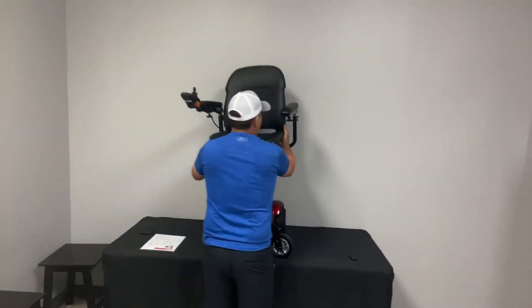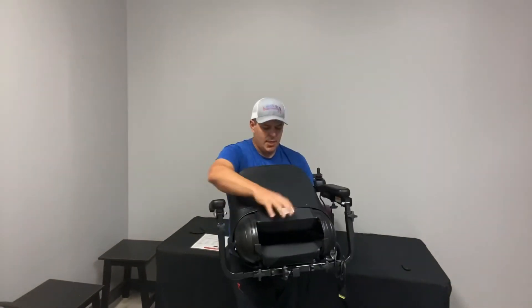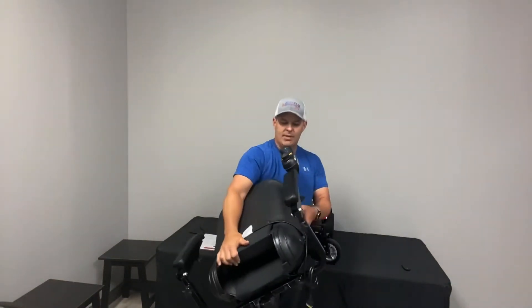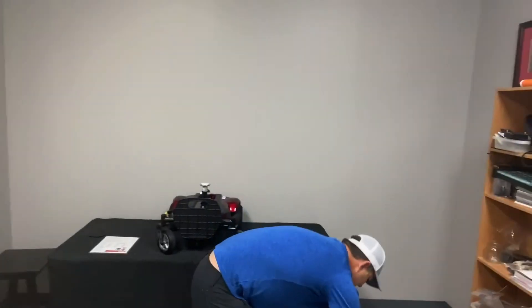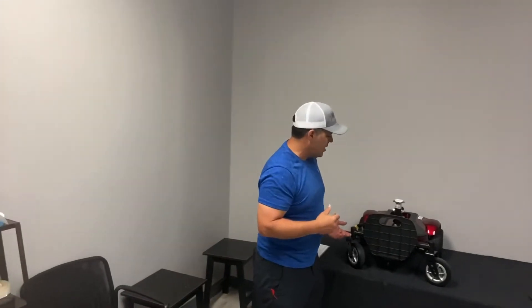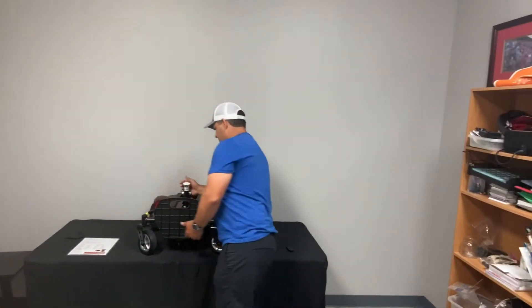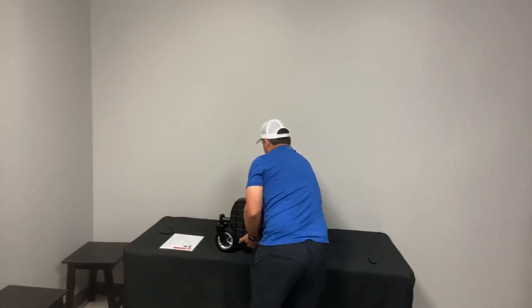When you take the seat off, just lift straight up like that. Your seat is going to fold down, which makes it pretty compact. You also need to take the armrests off for portability and transportation. One of the nice features is there's an actual trigger here — let me spin this around so you can see.